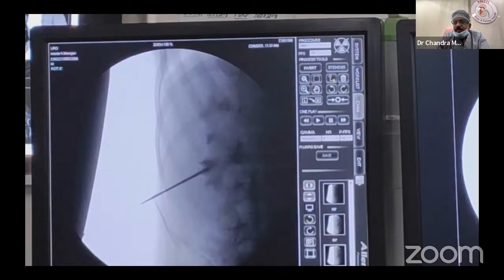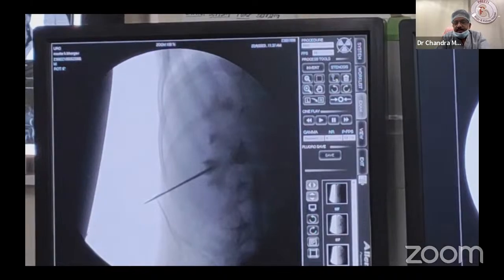That fine adjustment you can do in 30 degrees so that maximum movement of the calyx, maximum movement of the kidney happens. This is the most important point in supine PCNL, I must tell. Watch this next half minute. You see here. Fine adjustment.